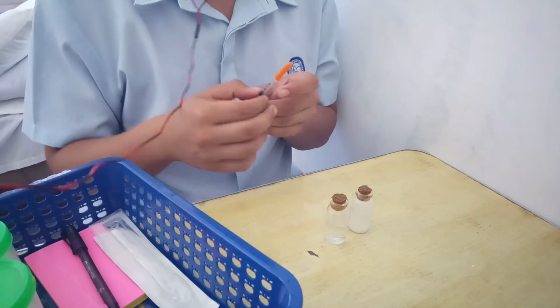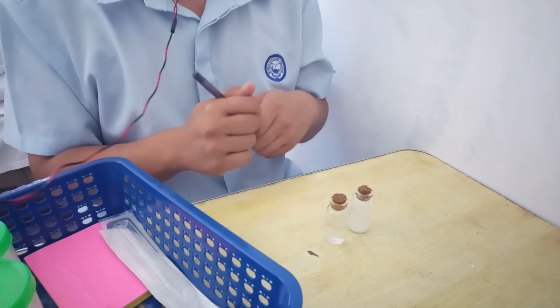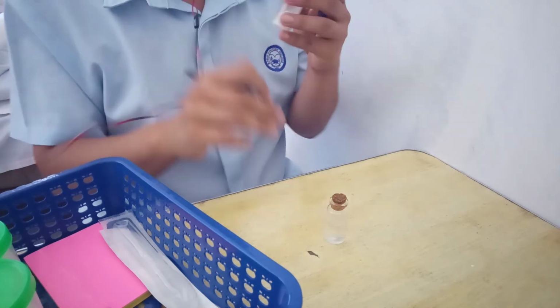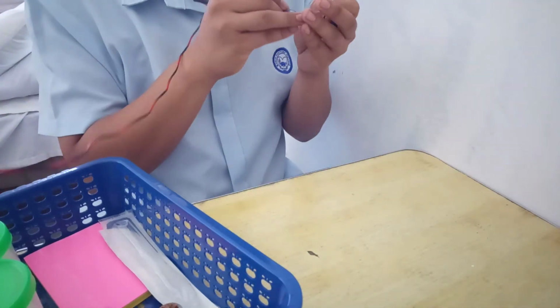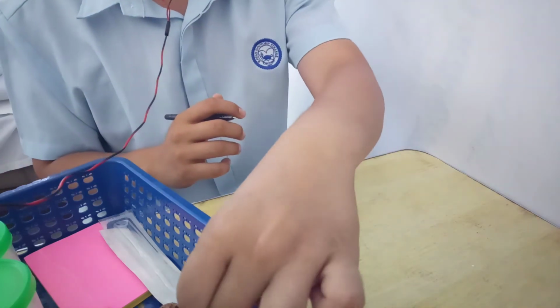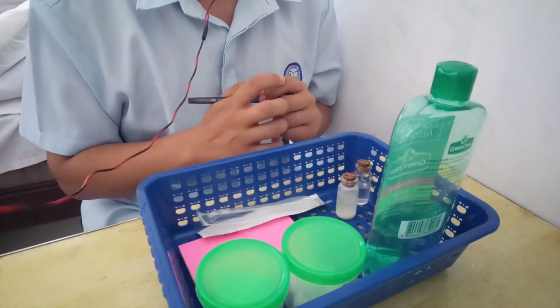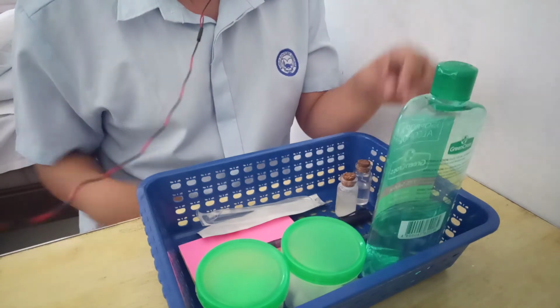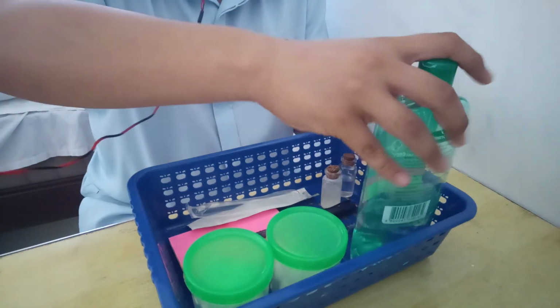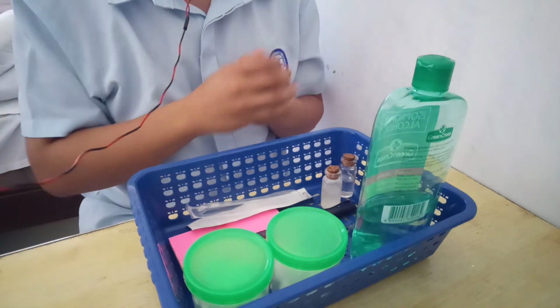So next thing to do is label the medication. Label the medication, the date and time it is opened. So today is 03/30/2022, for both vials. So store the vials containing the remaining insulin according to the medication storage temperature guidelines or according to the agency policy. Next is perform hand hygiene and proceed to the administration based on the prescribed route of the medication.